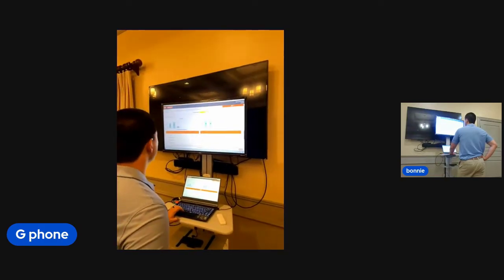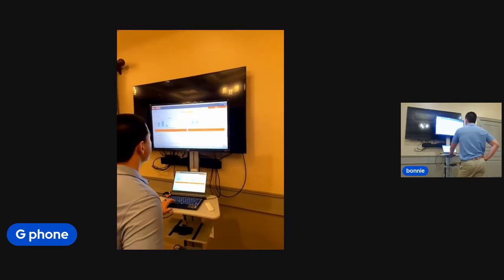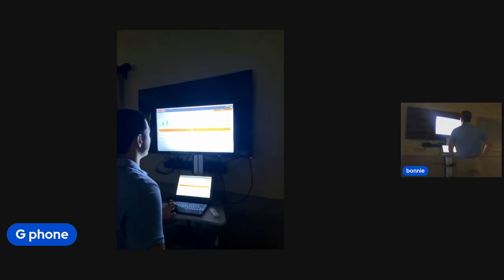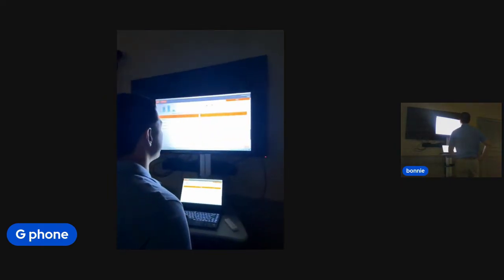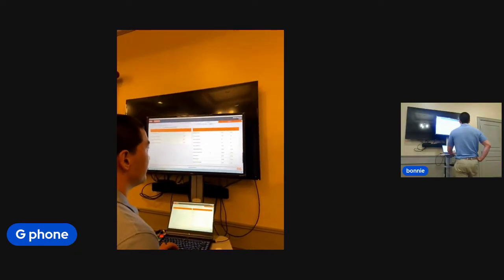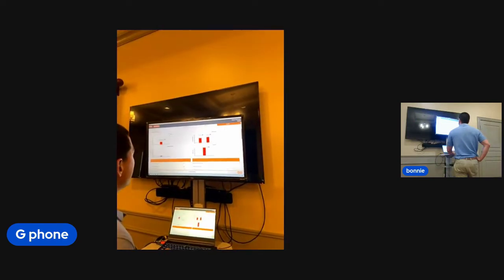The timed up and go, which we haven't talked about already, will show you stride length, step length, comparing the left to the right. It even gives us a difference here. And these are all things that I can work towards, the equalizing. What I like about this is it has double support time, so how long they have both feet on the floor, and I can make goals compared to this.